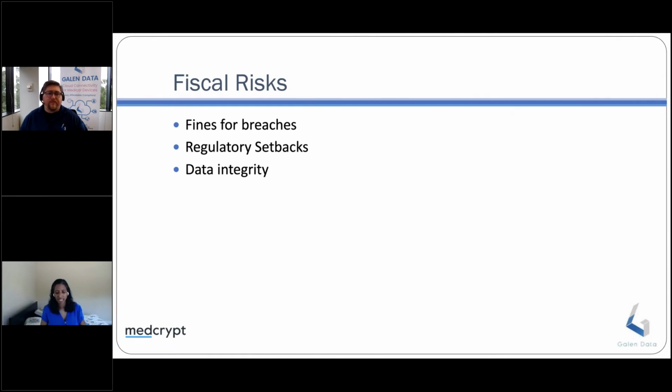I think it's a common fallacy to say, hey, it's guidance, it's not real, it's not final. The guidance is reflective of their current way of thinking, right? That's their definition of what guidance is. So they are viewing any submission in the light of what this expectation is. Now, are they going to hold you point for point to it? Probably not, but they are going to have a mature perspective in terms of, hey, did you set your keys to have a 30-year life? Well, that's not reasonable, because this device needs to be able to relinquish and re-provision keys as appropriate, right?